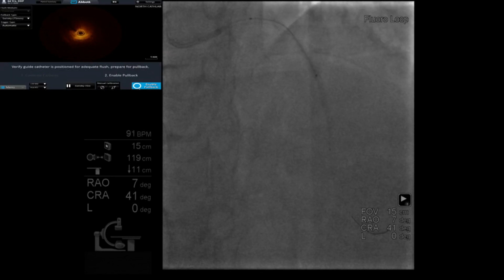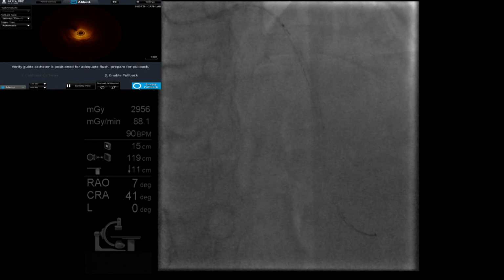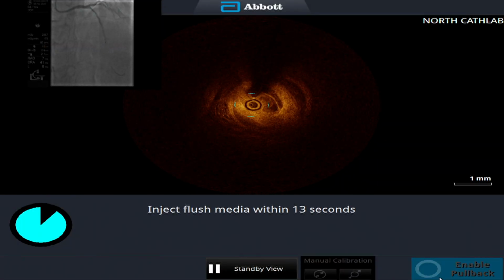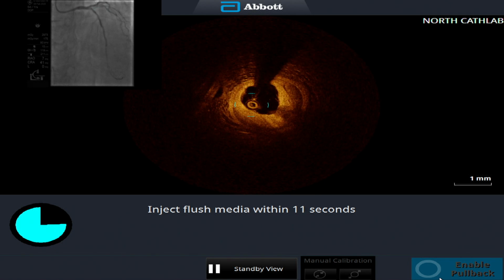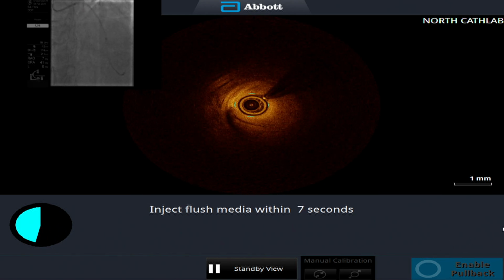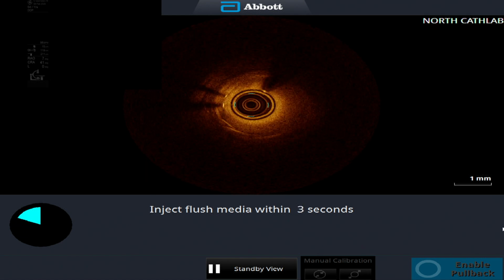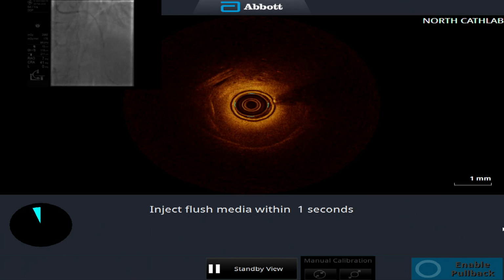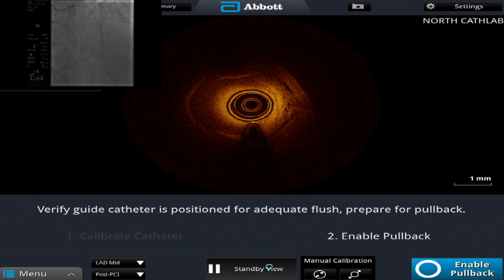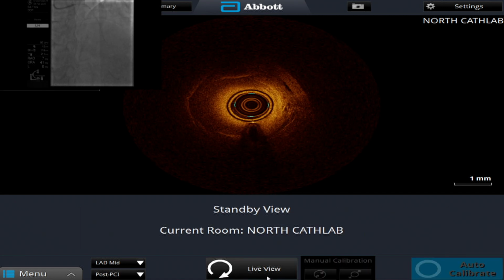I got to see this. I'm the guy that is trying to get 2.25 stents made illegal. No, not when you come here. Yeah, in the U.S. you see these in 4.0 vessels all the time. Yeah. You are going to do it again?